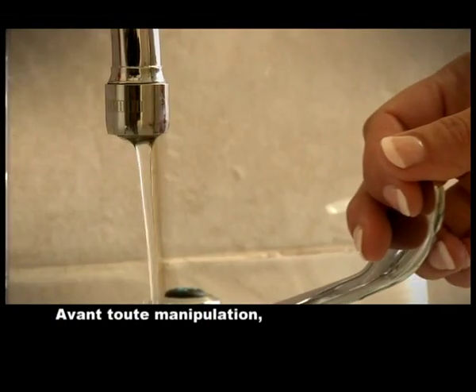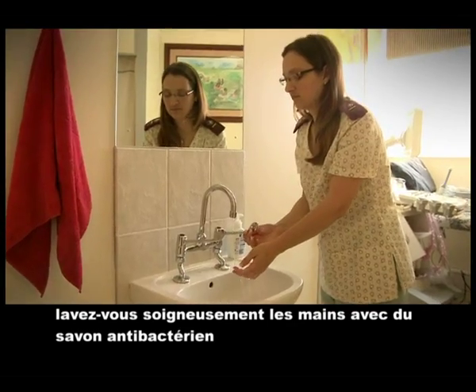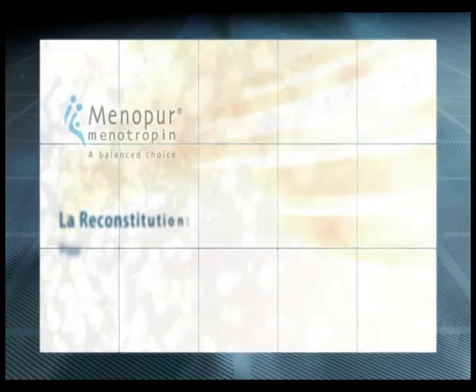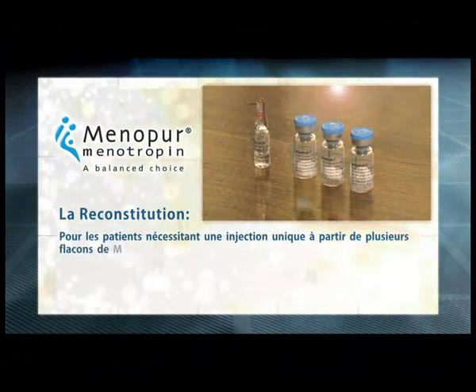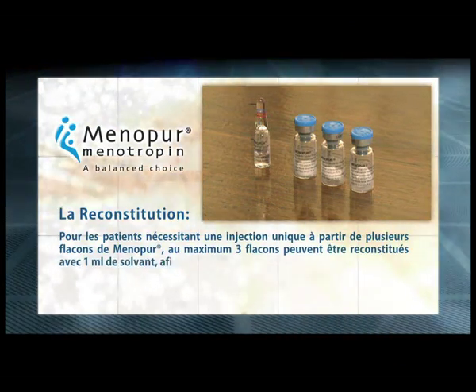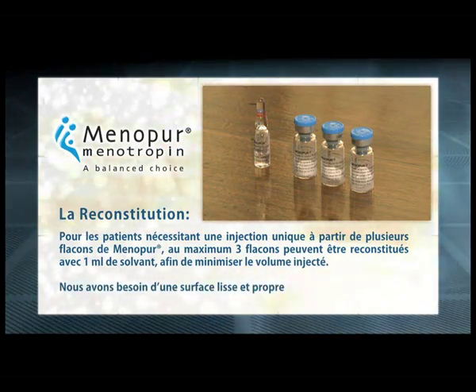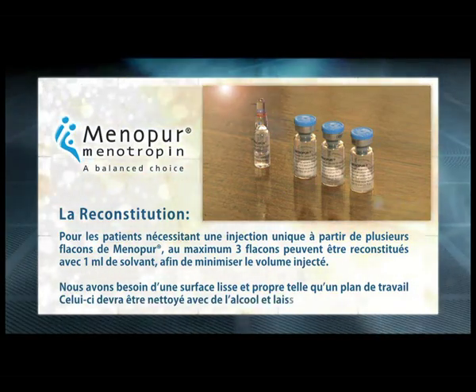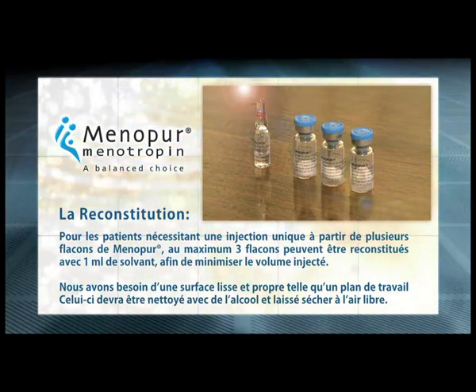Before you handle any of these materials, be sure to wash your hands thoroughly with antibacterial soap and dry them with a clean towel. For patients requiring a single injection from multiple vials of Menopur, up to 3 vials can be reconstituted with 1 milliliter of solvent in order to minimize the injection volume. We need a smooth, clean surface like a countertop. This needs to be wiped off with alcohol and allowed to air dry.